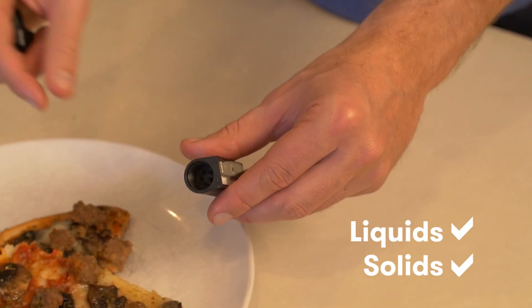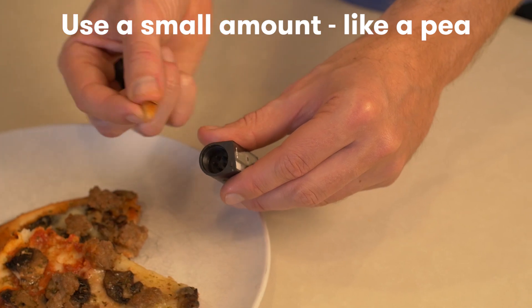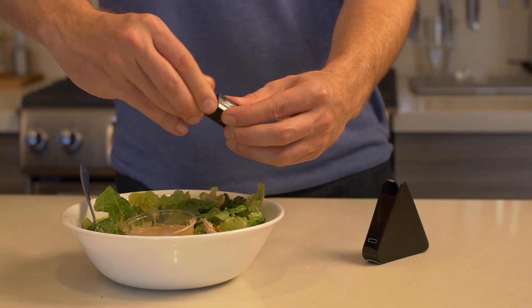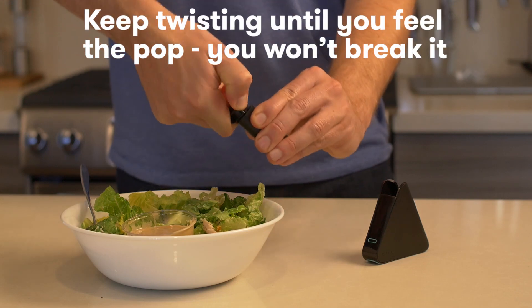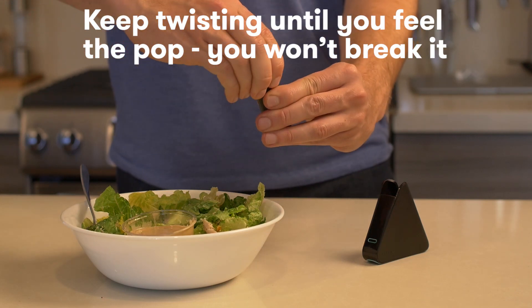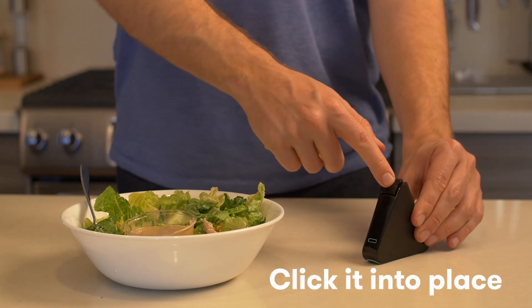NEMA can test solids or liquids. Remember, you don't need a big sample. Now you'll close the capsule. This next step actually grinds the food. You'll want to keep twisting until you can feel the pop and the top is aligned with the capsule. Now insert the capsule into NEMA and click it into place.